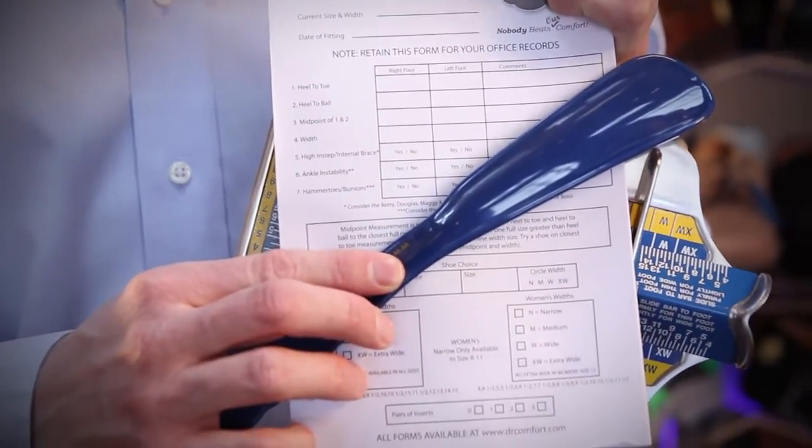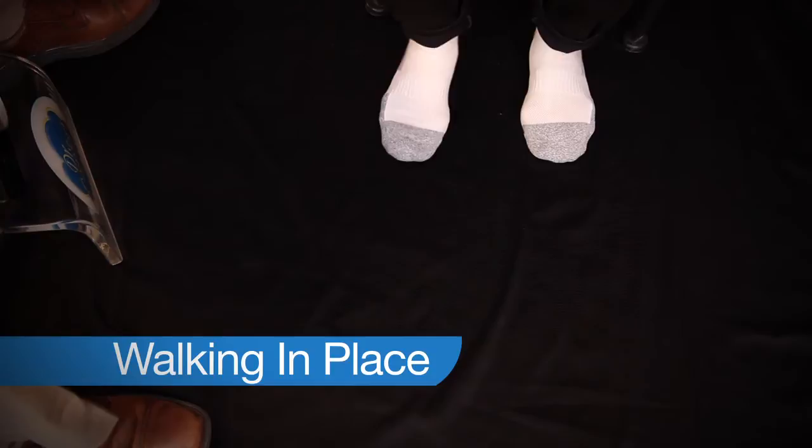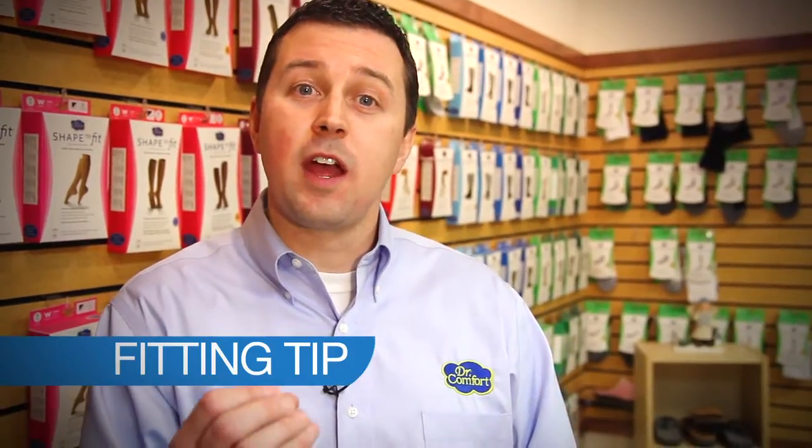And now I'd like to conduct a measurement and fitting on my good friend Jane. To begin, you will want to have the patient stand up and walk in place. A helpful fitting tip in this situation will be to make sure that you're having the patient walk in place. This will ensure a very natural position and will achieve the desired length and width when measured with the Brannock device.